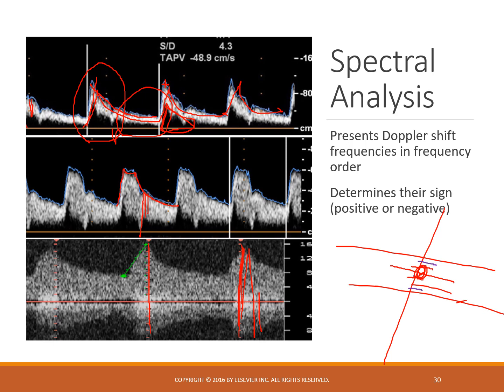And so I would get some lowered velocities. Therefore, I would go from lower to higher velocity, and that could account for my spectral broadening. Okay. So this, again, is low velocity spectral broadening.